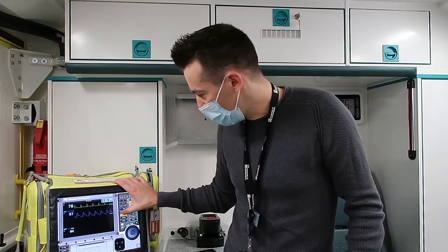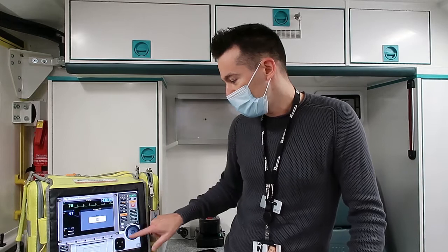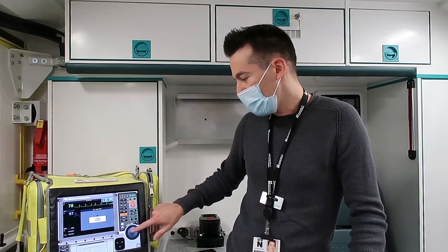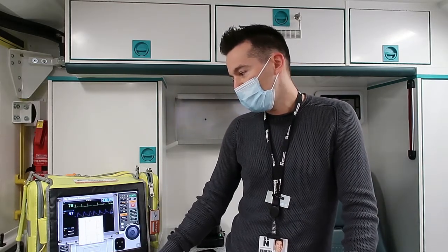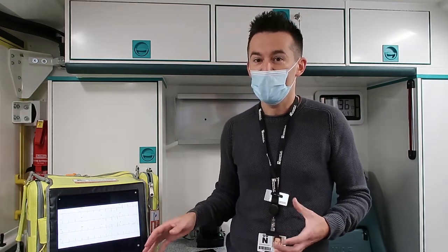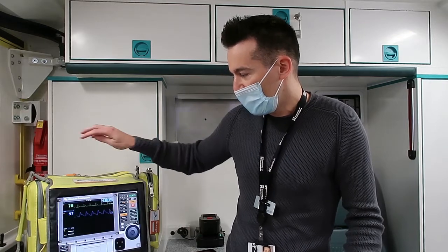I'll just stop that because it's quite loud - it sounds like an airplane going over. The other thing it can do is actually print off 12-lead ECGs, which helps tell us whether you're having a heart attack or not. You select the age and the sex, and then it will print out like a real ECG would, and we train you how to interpret these so you can tell whether patients are having a heart attack or not.